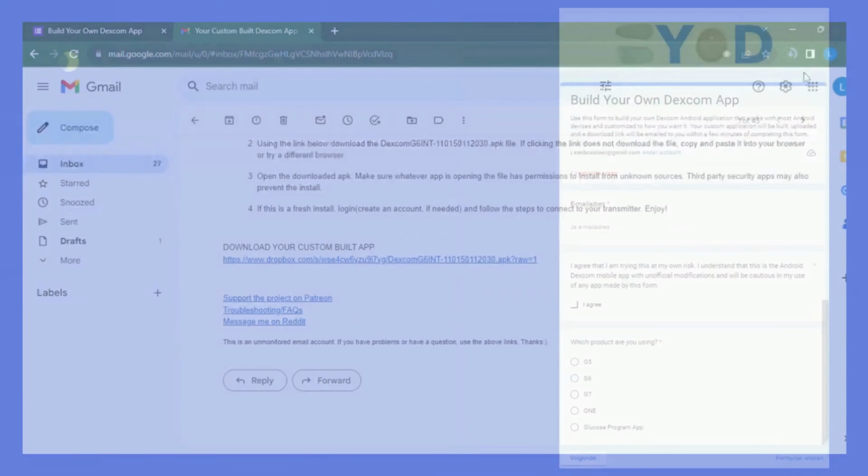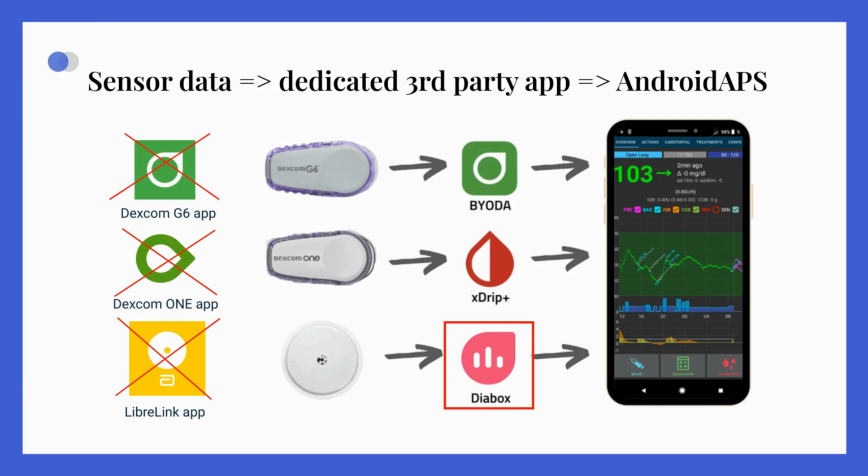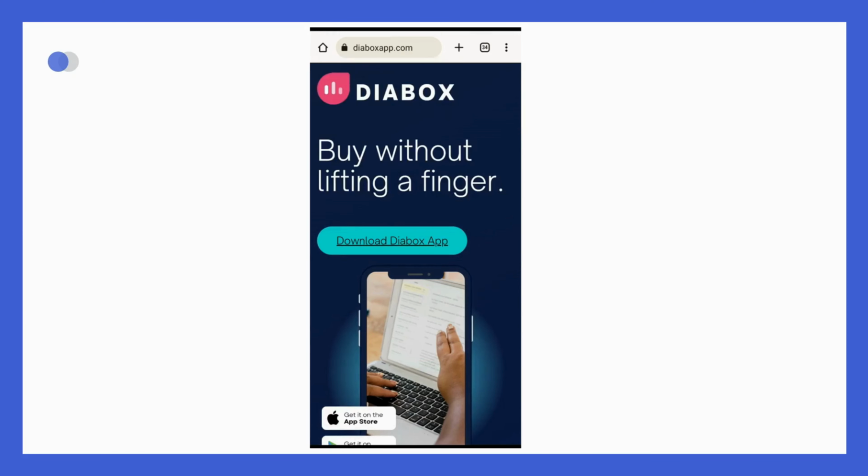When using xDrip with AndroidAPS, you gain additional features such as sharing sensor data with loved ones, customizable alarms, a smartphone widget, Android Wear support, Bluetooth integration for car audio systems, and Nightscout integration for comprehensive data management. If you only have access to Freestyle Libre 2 sensors, you can use the Diabox app, which is a variant of xDrip specifically designed for use with Freestyle Libre 2 sensors. To download Diabox, you can search for Diabox APK in a browser on your mobile phone. Once downloaded, open the file to install the app.